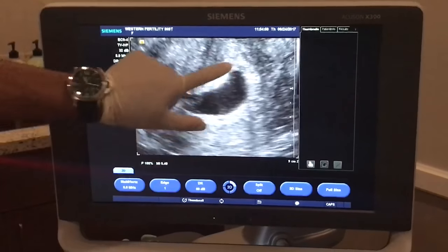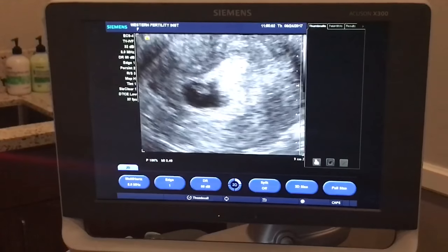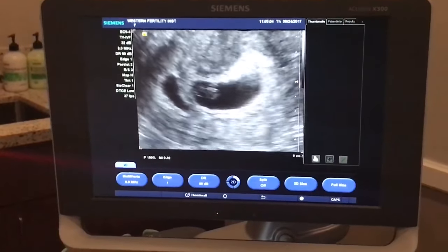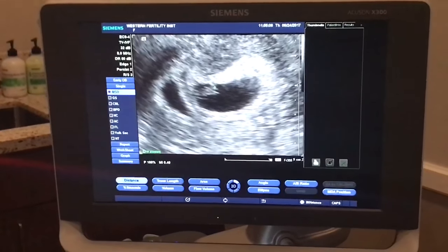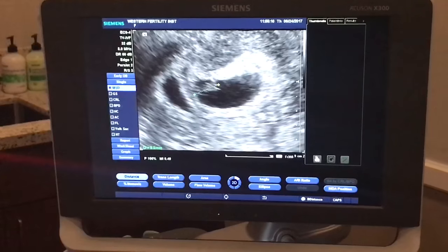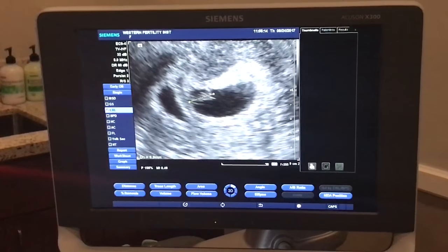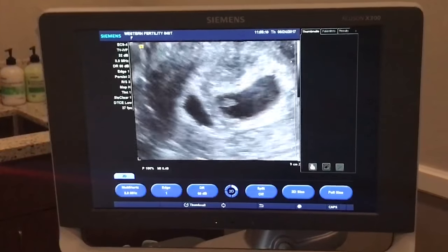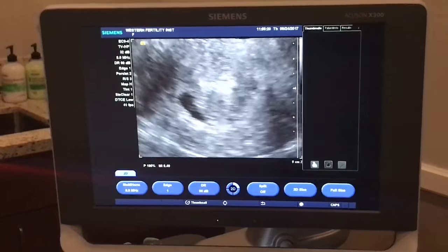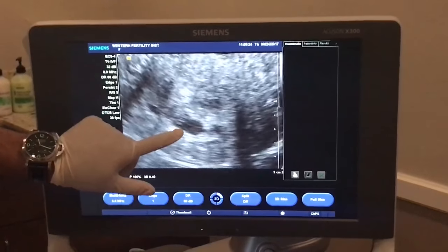This is the yolk sac, the gestational sac, and the baby itself. This is the second sac, but it's empty.